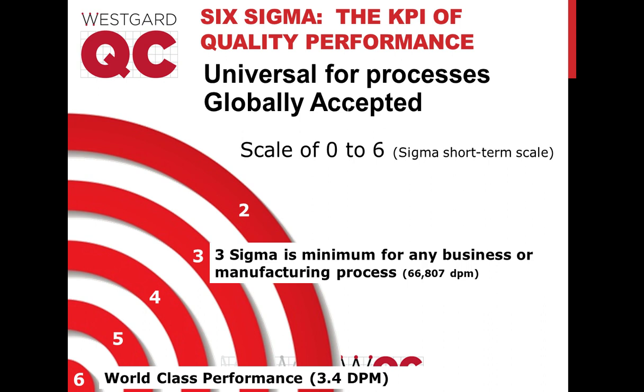And in a single CBC run, there are several parameters. What if sigma varies per parameter? And how should we collectively rank sigma in a single CBC?